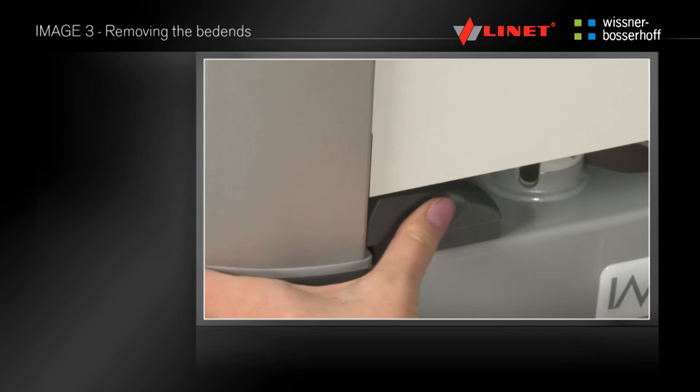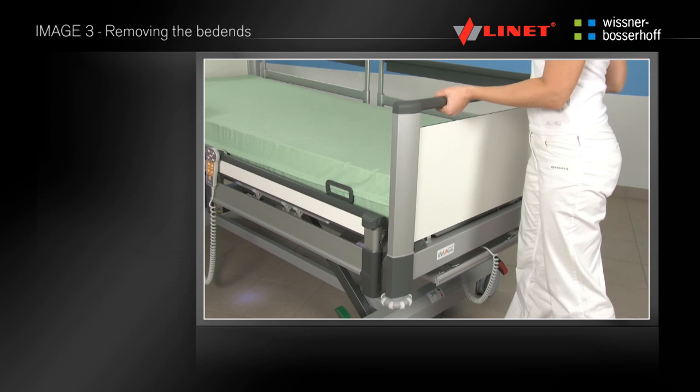Unlock the front by pushing and rotating the locks, then remove the front upwards. Perform this procedure in reverse to install and fix the bed ends to the bed.